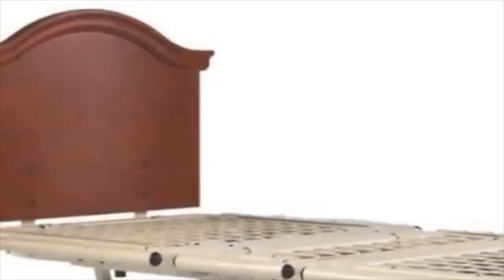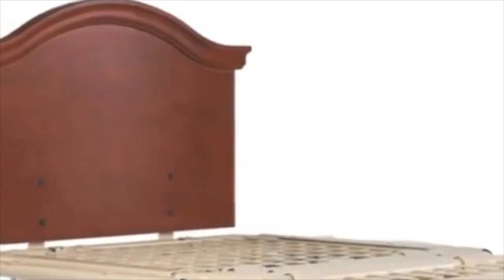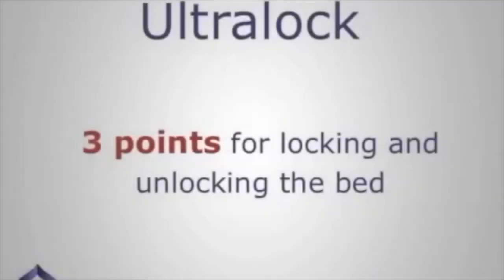position. Headboards are not secured to the UltraCare XT frame. Caregivers are able to lift the headboard up and place it under a resident if there is a need to administer CPR. The UltraCare XT comes with either one of two methods for locking the bed.